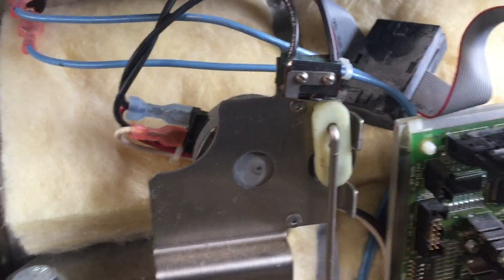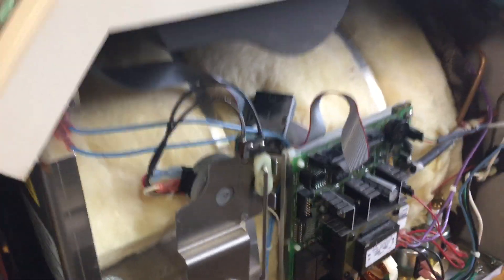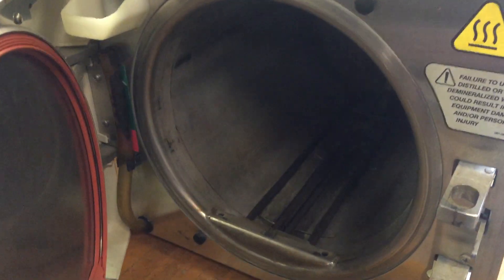This is the Midmark M11 and M9 sterilizer for autoclaving. This machine is very reliable, very durable. And inside you see this chamber and the heating elements.